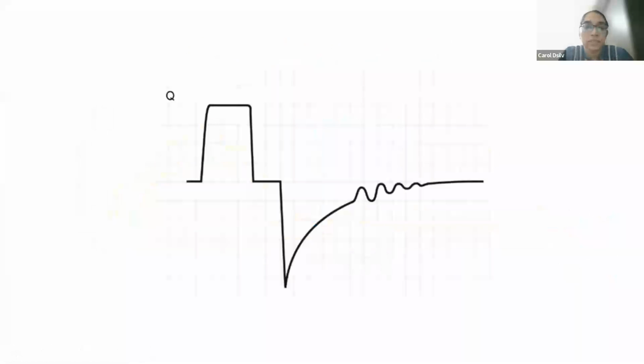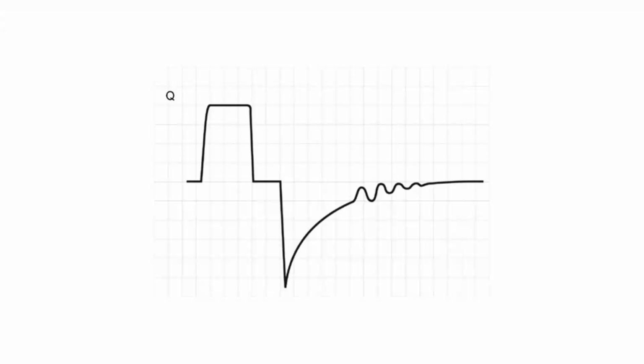Okay, fine. So this is the next question. Can somebody tell me what you are seeing over here? This is an easy one. Secretions in the circuit. Inability to trigger the ventilator.